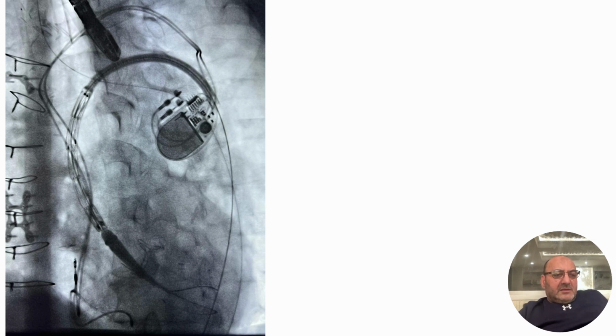And you see delivering the graft through this acute angle in the arch sometimes takes skill. You have to sometimes even place the wire basically in the heart. And sometimes if you have a mechanical graft, there are special devices where you have a short tip. Some people develop techniques where you can go through the leaflet of the mechanical valve and do it that way, but it's quite challenging to get the wire and be in that area.